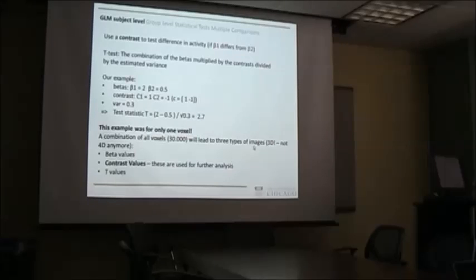And of course, this all happens within SPM. And what it basically leads to are 3 types of images, which are now, and it's important always to realize that they're 3-dimensional now, not 4-dimensional. So right, the whole pre-processing and raw MRI data has not only the 3 spatial dimensions, but also a 4th time dimension, right? It's a time series.